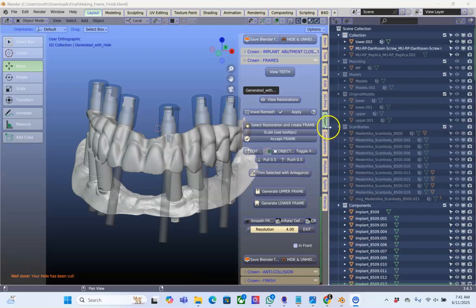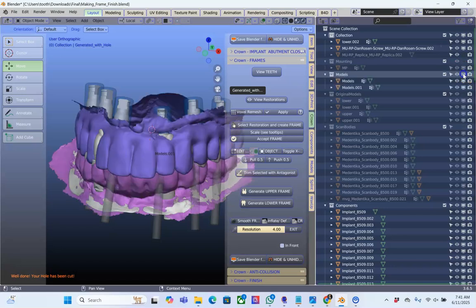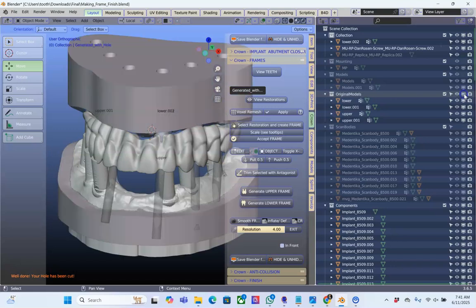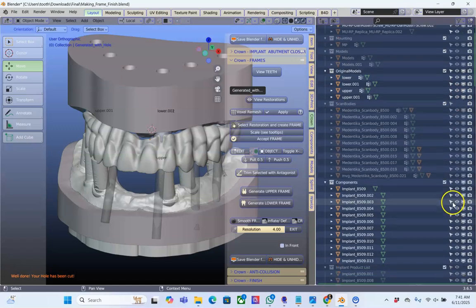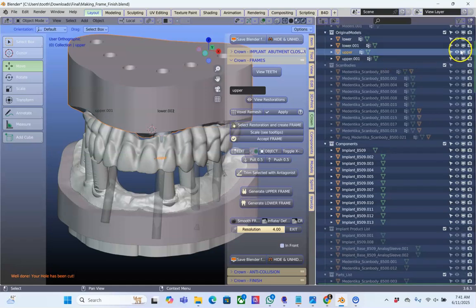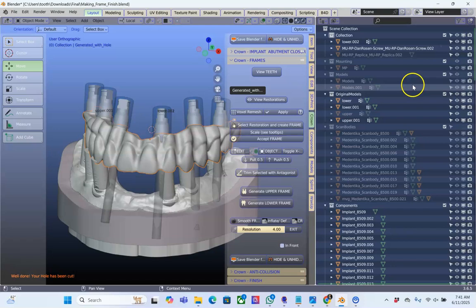So in this next part, I'm going to do the lower frame. First of all, I've got to just find and see what is happening in this collection. Okay, so we need the lower model. This is correct. And we need the wax up. This model we don't need. I'll just hide that. This one we don't need either because we finished with that now.